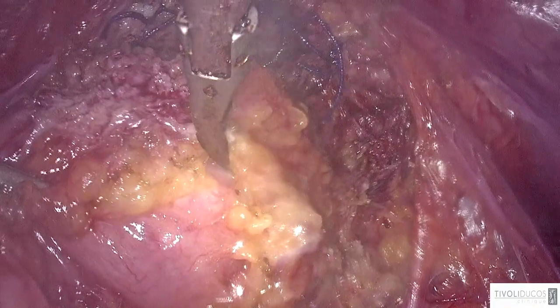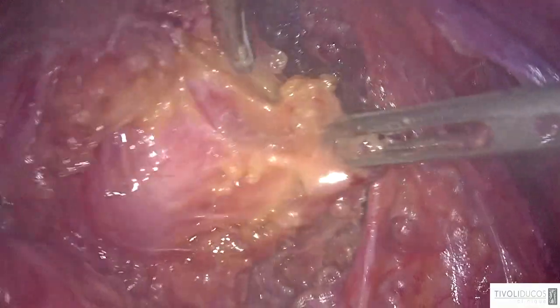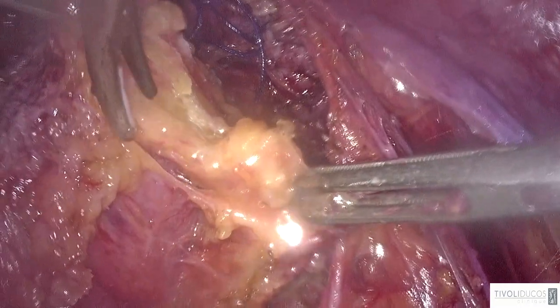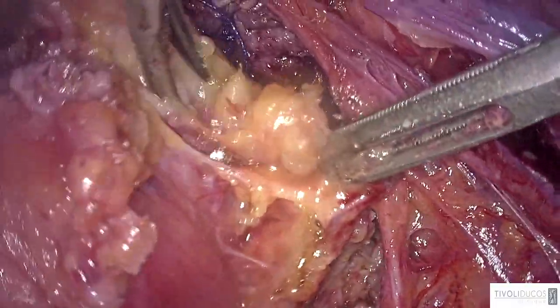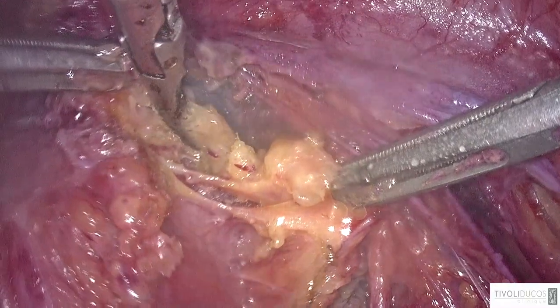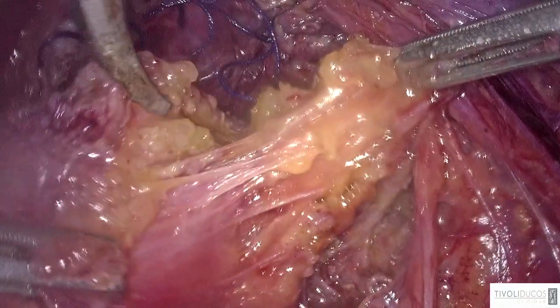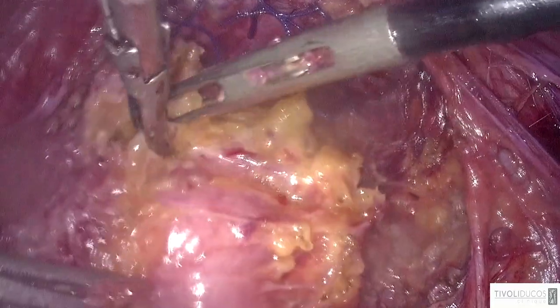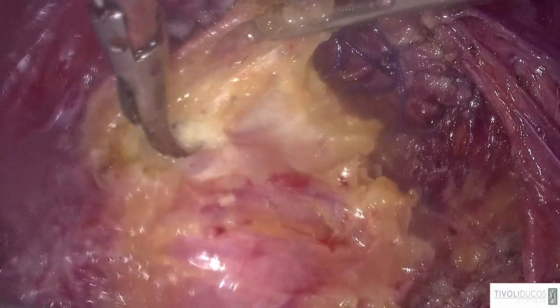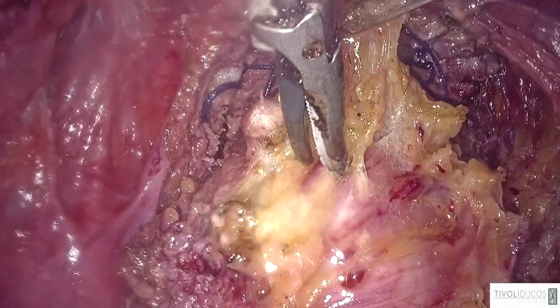This is the step I don't like too much because it is very annoying, but it is mandatory, absolutely mandatory. And we received a lot of people coming to see us performing disc excision, and most of them actually tried to do it in their units, and from time to time they told me it does not work. And in a majority of cases, I think the problem was that the shaving was not enough, and the removal of the fat tissue was not correctly done, because it is annoying, and because at any moment you can feel that it is okay, we can go forward.